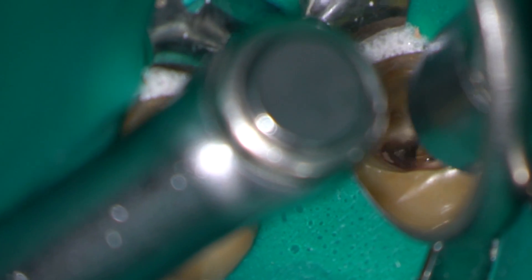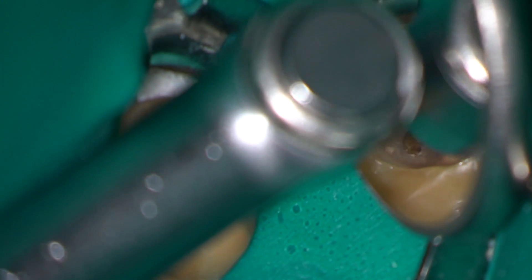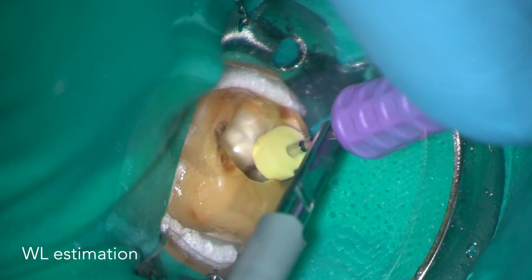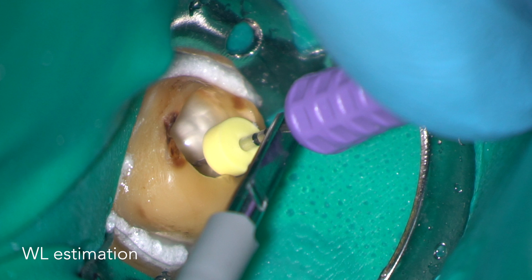Here I'm using a ProTaper SX instrument to flare the coronal part of the root canal as I start to make a glide path down to the full working length. An electronic apex locator is used to estimate the working length. Sometimes a little bit of solvent can be useful.